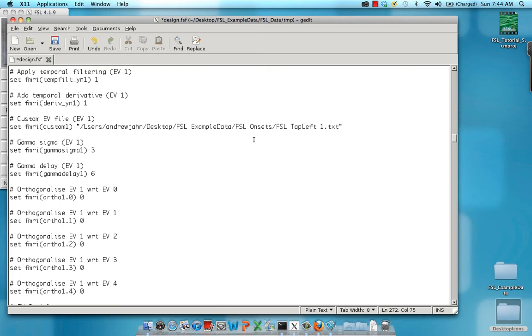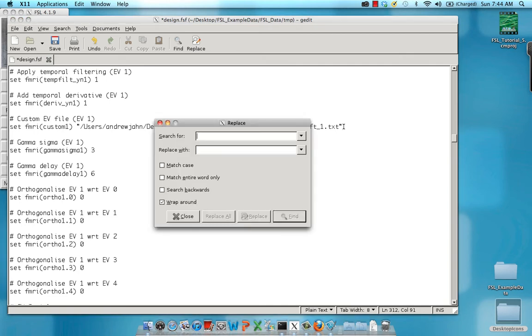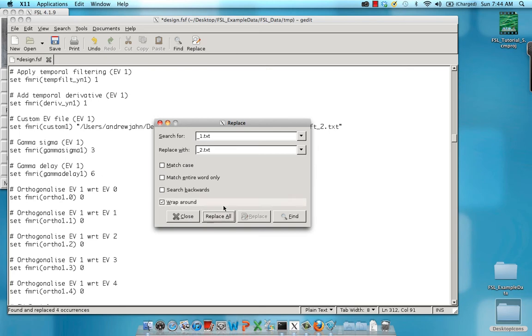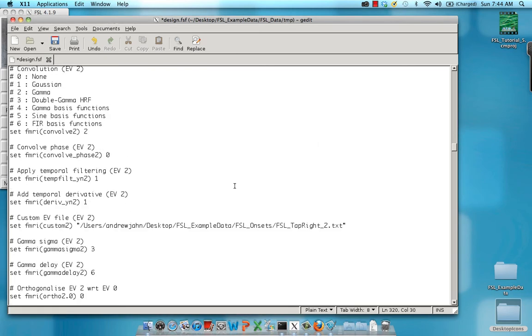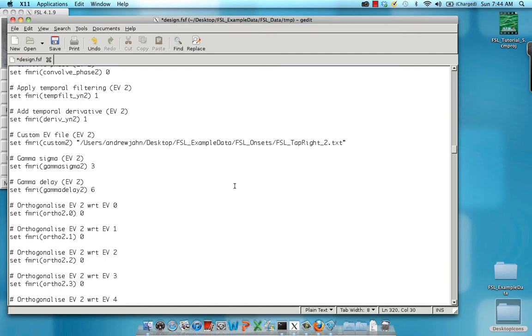Scrolling down, we see that each of these text files has something like tap left underscore one to represent run one. So what I'm going to do is I'm going to search and replace and replace underscore one dot txt with underscore two dot txt. This is to represent that now we're looking at the next run, run two. So that made all the replacements. You notice that all these are now run two.